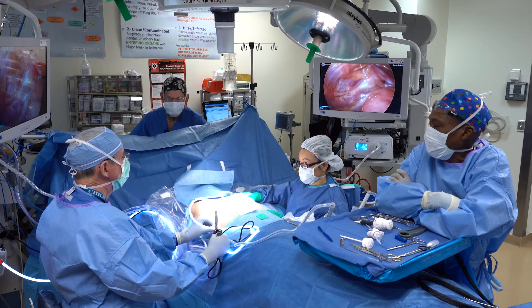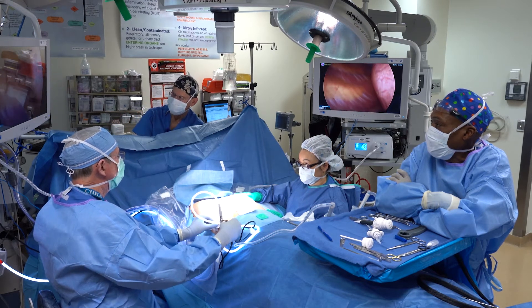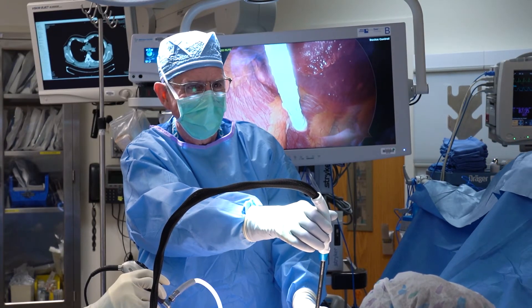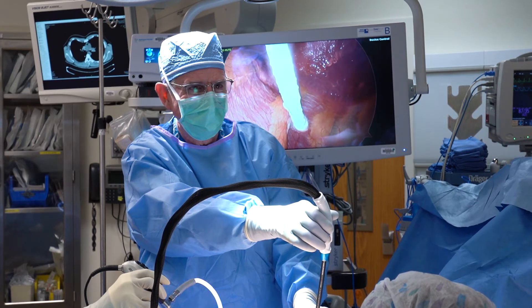For the operation, we utilize thoracoscopy to improve safety and visualization of the dissection. The right lung is typically collapsed using carbon dioxide insufflation, and then a tunnel is created beneath the sternum using specialized tools to safely do that. Once that path is created, a substernal bar is created and flipped into position to restore normal anatomy to the chest wall.